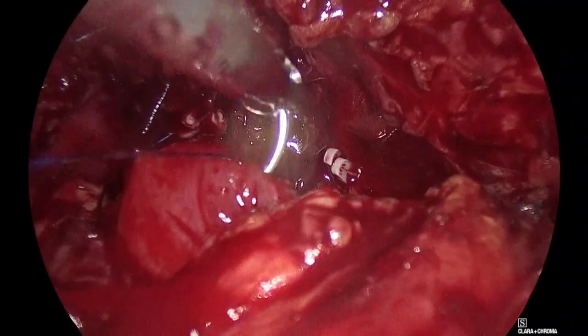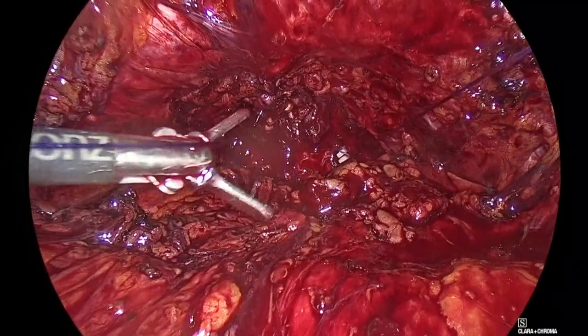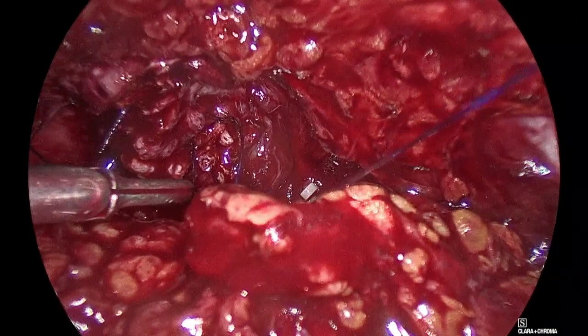I think it's interesting you get such a good length of urethra, yet when it's divided, it falls away into the pelvic floor. This is always a problem because you are pulling. So now what we do is we start pulling down. Come in. We start pulling down, and you will see that this will come down now. Slowly. We might juggle. Look at the sutures here. They need to be both tight.